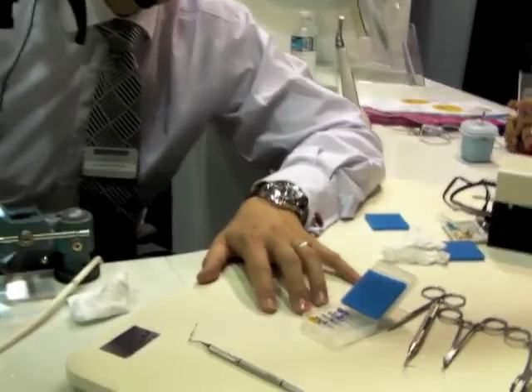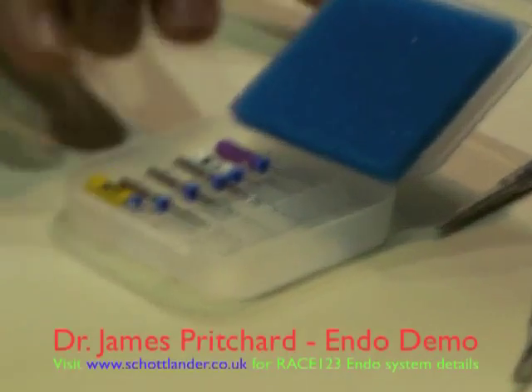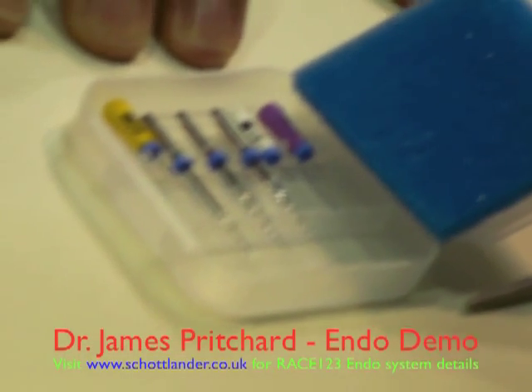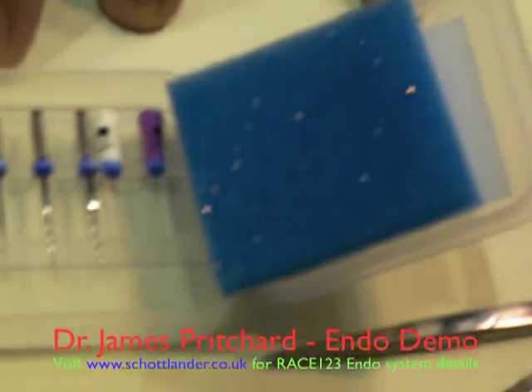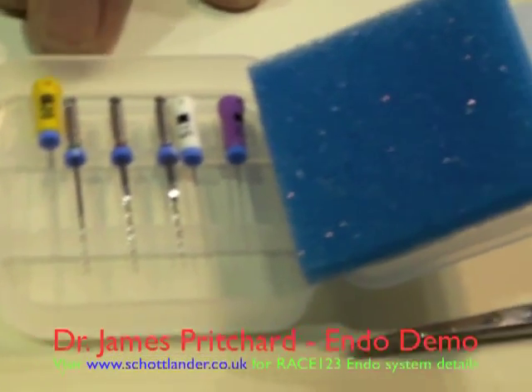This is Race 1-2-3, which we've just launched at this show. It is a combination of three nickel titanium rotating instruments and three stainless steel hand files. The stainless steel hand files are a size 10, 15, and 20, and the rotary nickel titanium files are a 10-06, a 2505, and a 3504 — called the T1, T2, and T3.